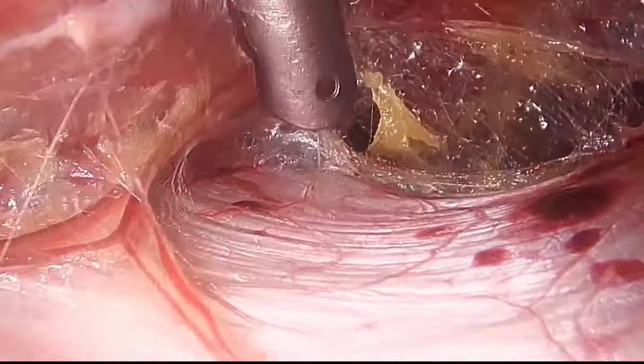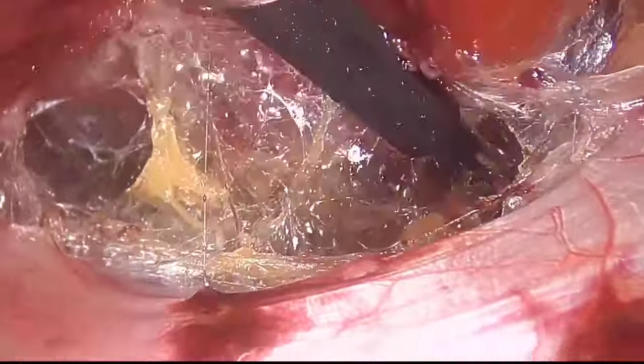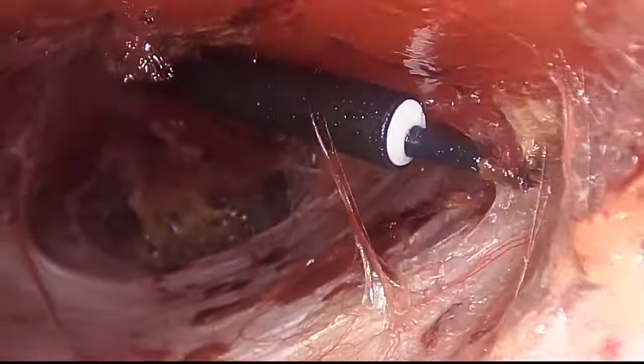After putting one port in the left upper abdomen in the retrorectus plane, I placed one more port lower down, below the level of the umbilicus, medial to the linea semilunaris, and tried creating further space using the hook.